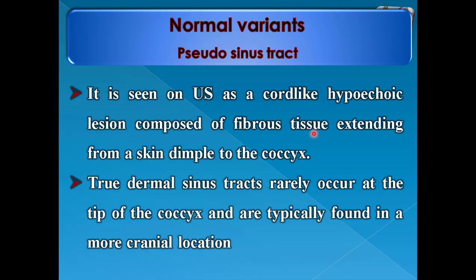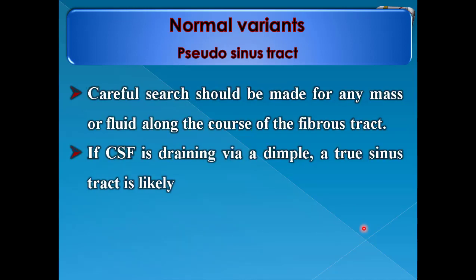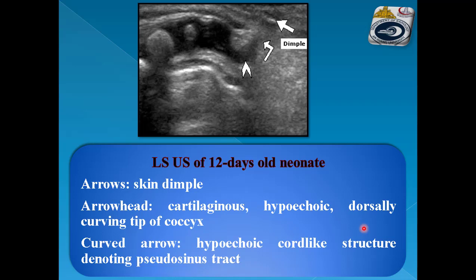Pseudosinus tract is seen on ultrasound as a cord-like hypoechoic lesion composed of fibrous tissue extending from the skin dimple to the coccyx. True dermal sinus tracts rarely occur at the tip of the coccyx and are typically found in a more cranial location. If CSF is draining via a dimple, a true sinus tract is likely whatever the location. This example shows the tip of the coccyx with the cord-like pseudosinus tract and the skin dimple.